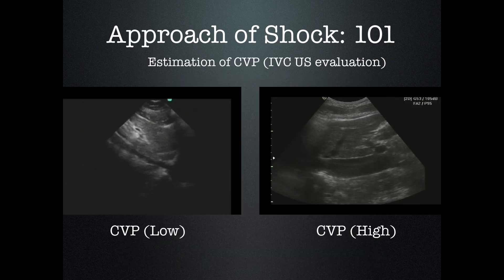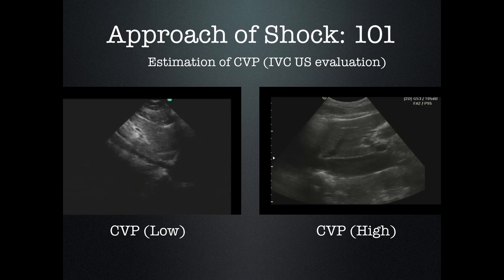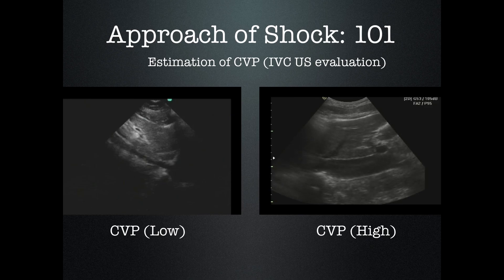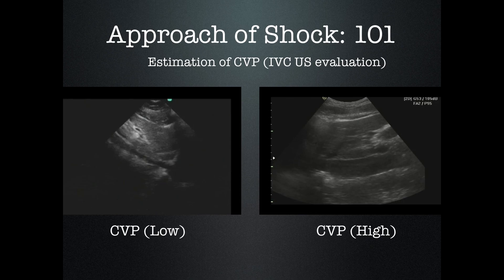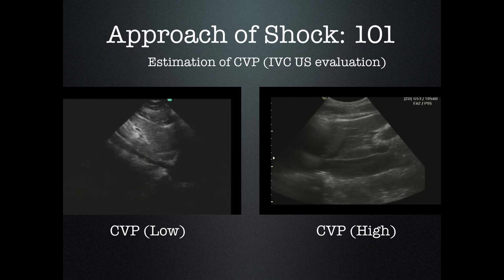What I'm not happy about is where it's flat and completely collapsing with respiration, or it's not collapsing at all. That's a normal example. Where I said CVP low, you can see it's almost undetectable versus the one on the high side where it's not collapsing at all. You can estimate central venous pressure simply by looking at this IVC. If it's flat with walls completely touching during respiration, CVP is going to be anywhere between 0 to 10. If it's high and not collapsing, it's greater than 20. Anything in between, I consider it normal.